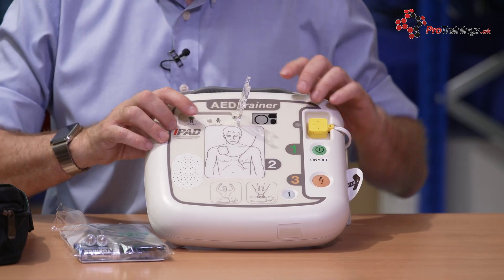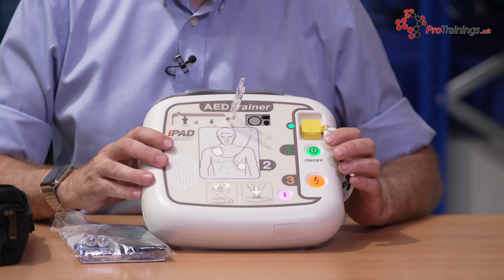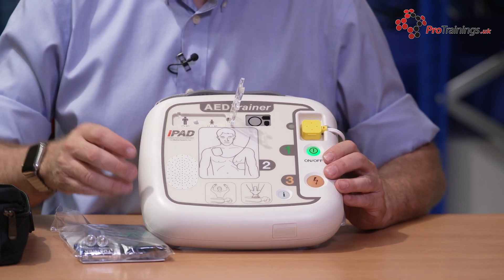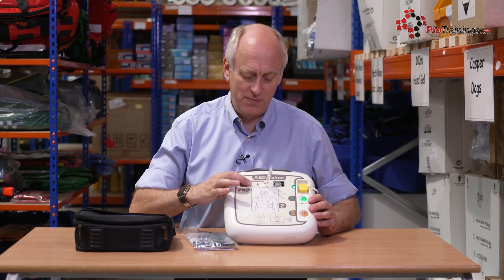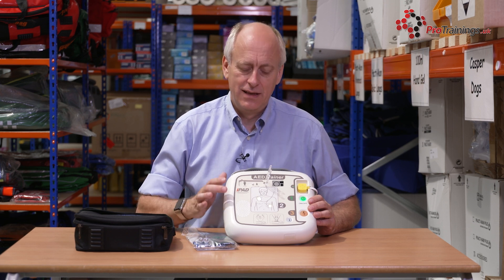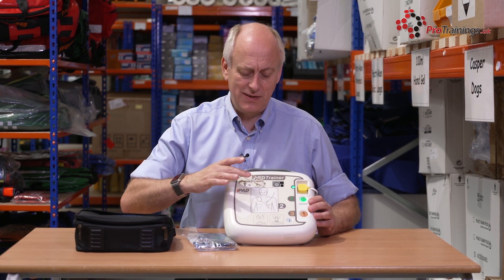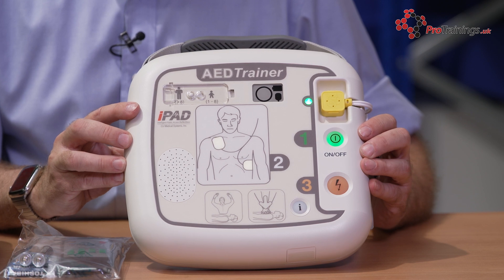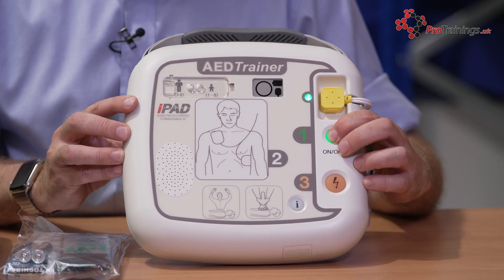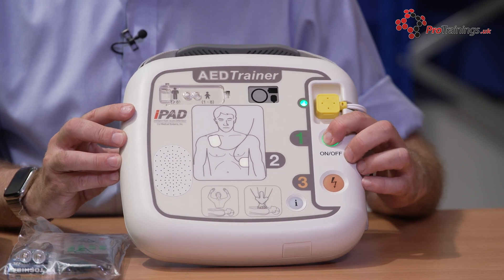To show you the sounds and how the button works, if we switch it on, you'll see it first tests that all the lights are actually working. In the same way, it will tell you what the live unit will do — so it starts in adult mode. If you switch it to child mode, each time you do that it will give you voice prompts for exactly what you want. You just cover that over and it stops it being accidentally pushed. To shut it down, just push and hold the button.